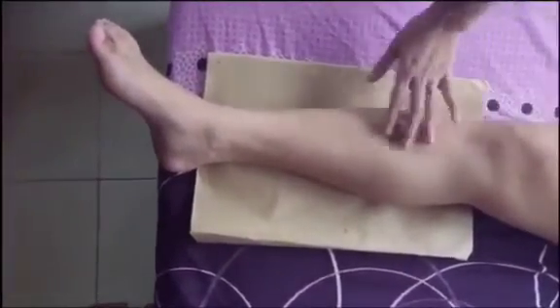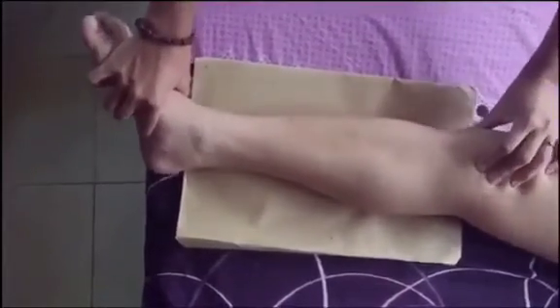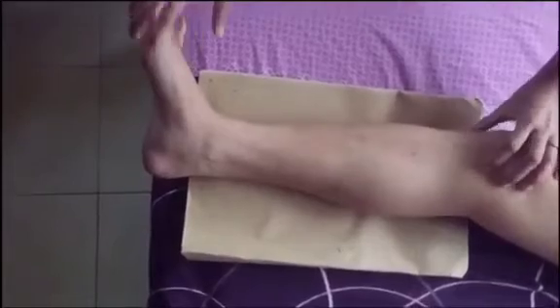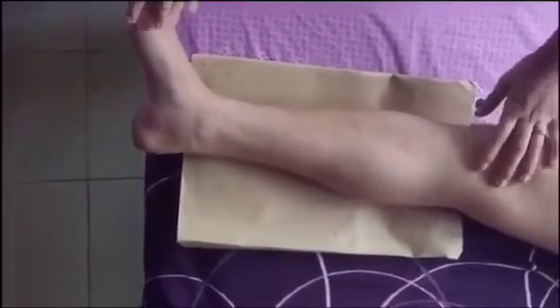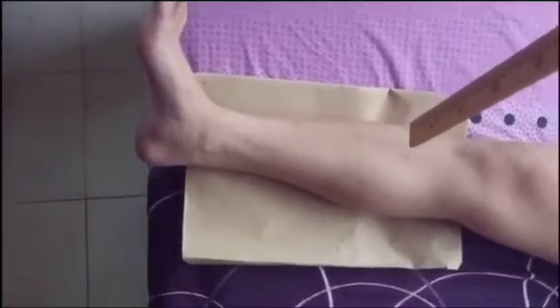Next one is the lateral rotation. So we're going to laterally rotate the leg 45 degrees. Here we're going to demonstrate the fibula superimposed by the lateral portion of the tibia.